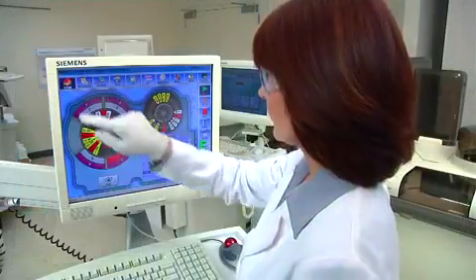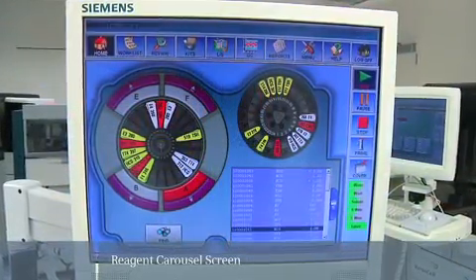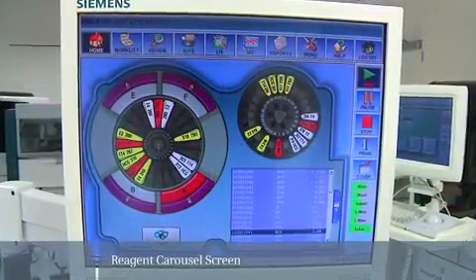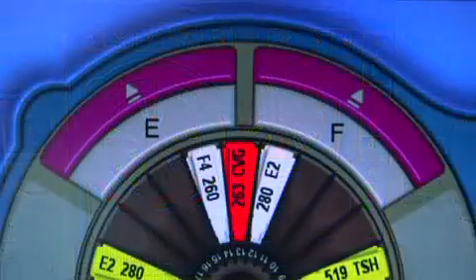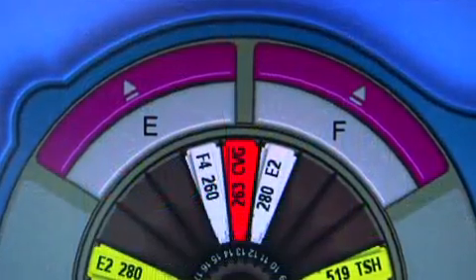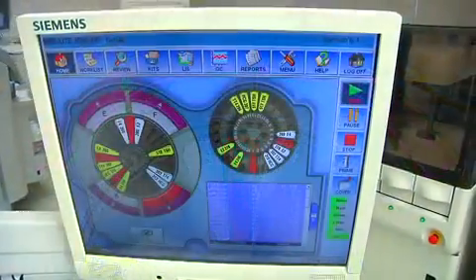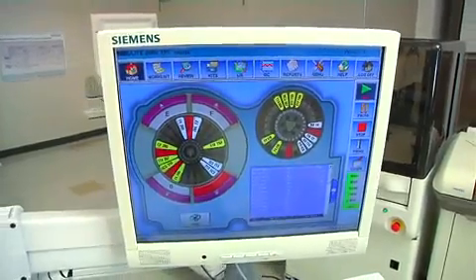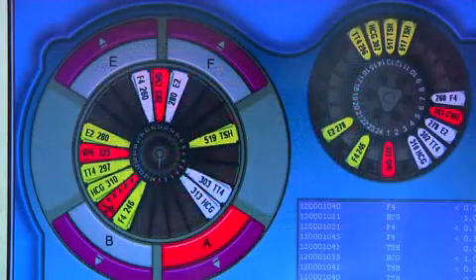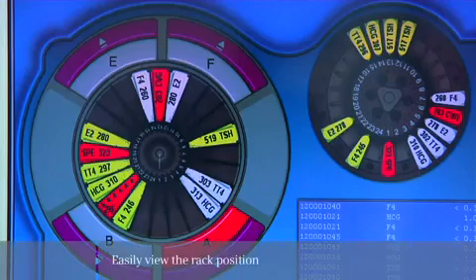Directly from the home screen, you can operate and obtain information about the reagent carousel and the bead pack carousel. The status screen provides information such as the number of the reagent wedges on board the instrument, how many tests are left in each wedge, reagent lot number and status of each test wedge, just to name a few. The gray outer ring from the reagent wedge has images of the 6 sample racks, which holds up to 90 sample tubes on the instrument.